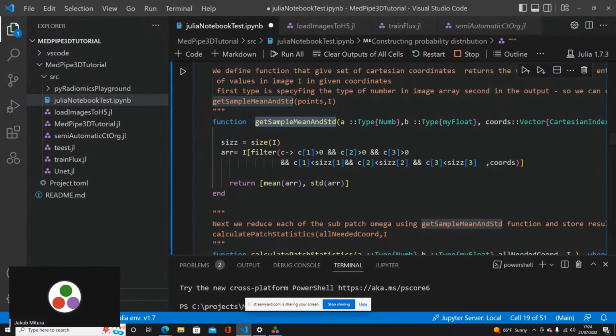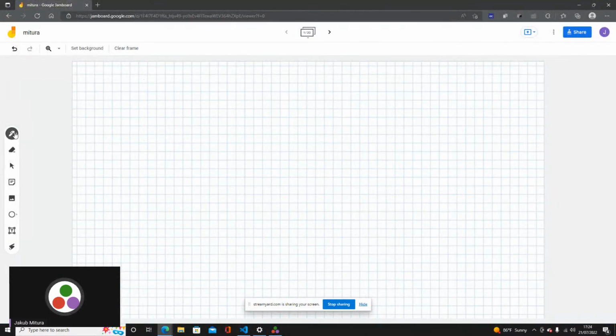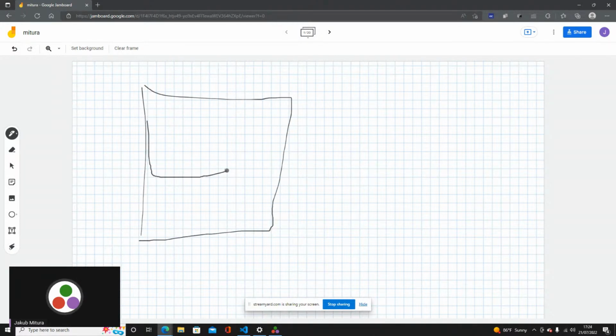Maybe I will explain the idea here now. We have this data, a grid of voxels. We know that the liver is somewhere here. We chose some voxel here, and we know its Cartesian coordinates. We defined some set of Cartesian coordinates around it, and in this green circle we have a set of voxels, which is just an array of numbers.